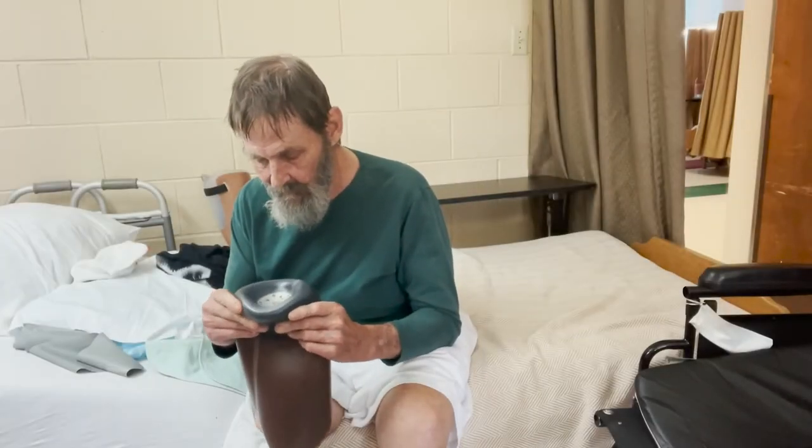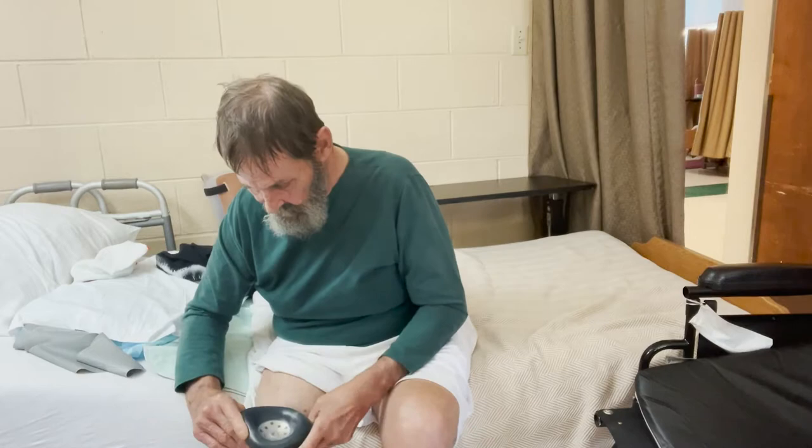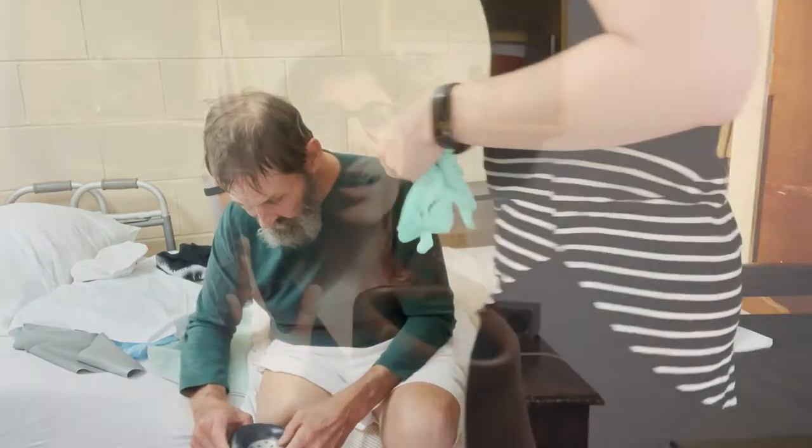The first thing to notice is that he is getting the liner completely inside out and as flat as possible. Whether it's a locking liner like this one or even a cushion liner, it is important to have it as flat as possible against your skin — any air pocket in there is going to create a vacuum, basically giving yourself a hickey.